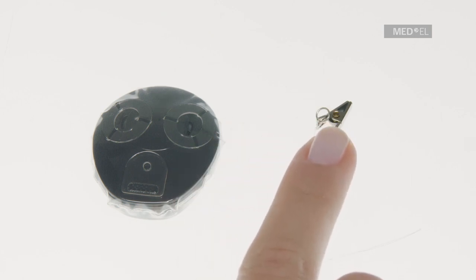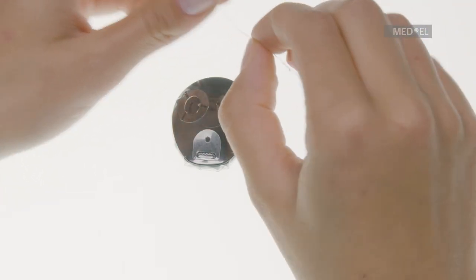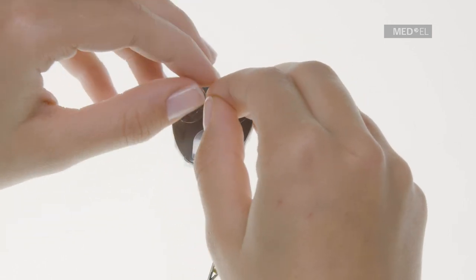To avoid losing the processor during activities, you should use additional fixation, such as the Med-El sports headband, a swimming cap, or an attachment clip. To tie an attachment clip to Waterwear, use the semicircular flap on top.